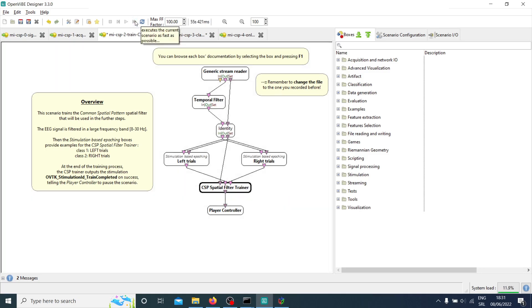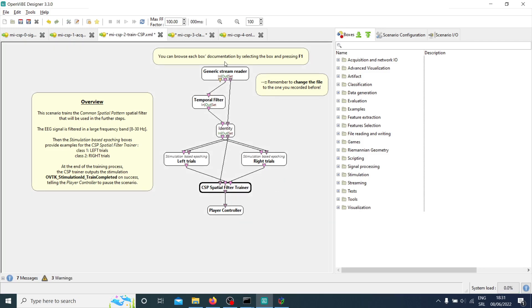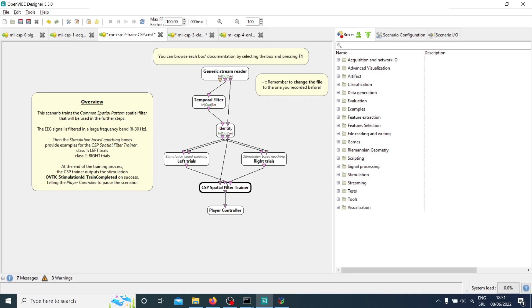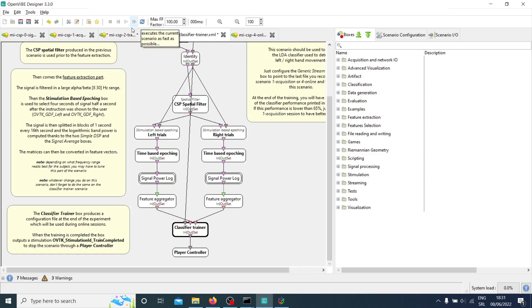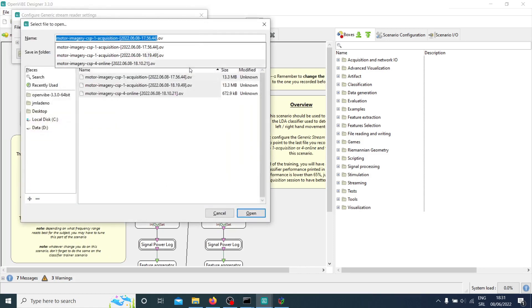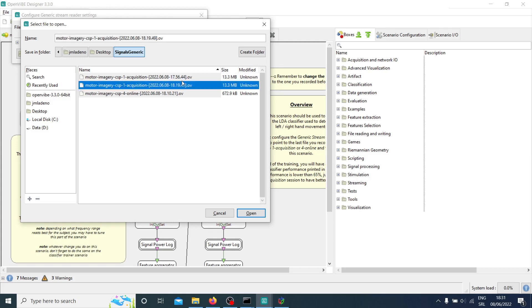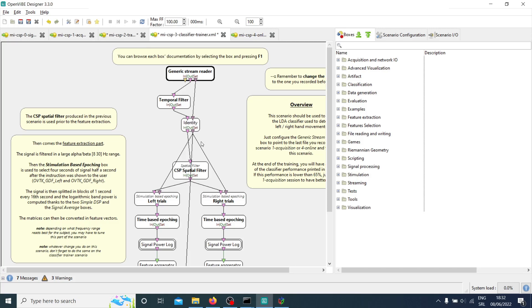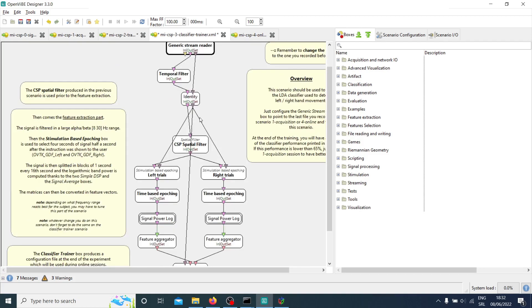I'll fast-forward through the training. It ended correctly. As I mentioned, if you had stopped the Graz visualization interface early and then pressed play on this scenario, it would never end — it would never detect the end-of-file marker and would just keep running forever. So it's very important to let each scenario end by itself. Now let's train the classifier. I need to make sure I'm using the new file I just recorded, not the previous test one.